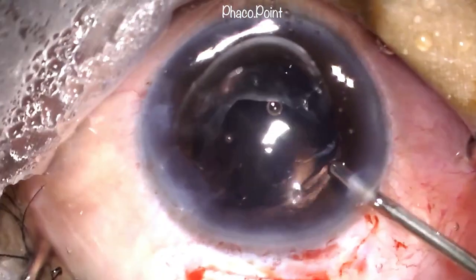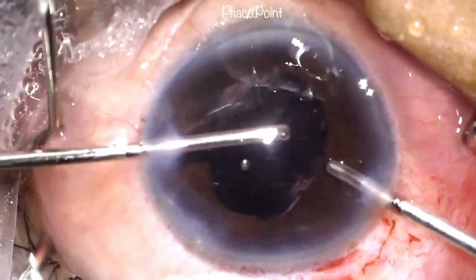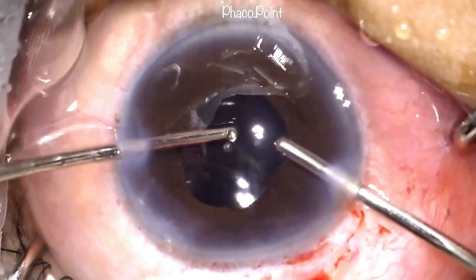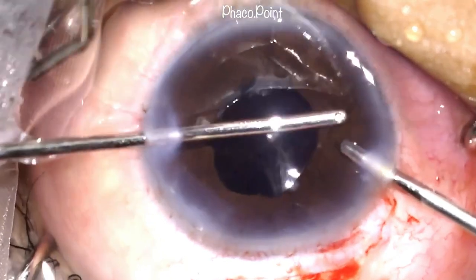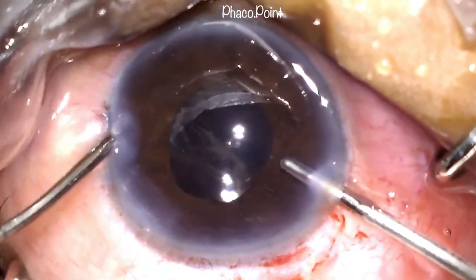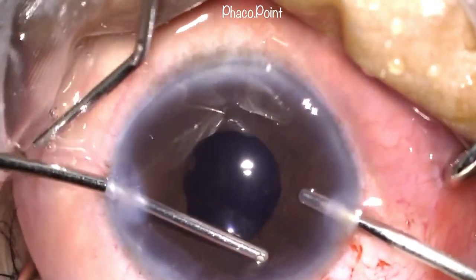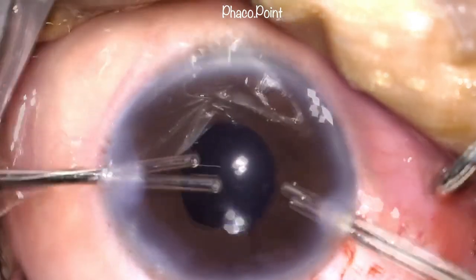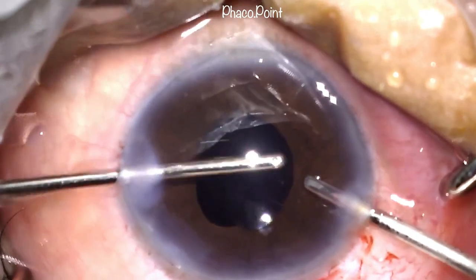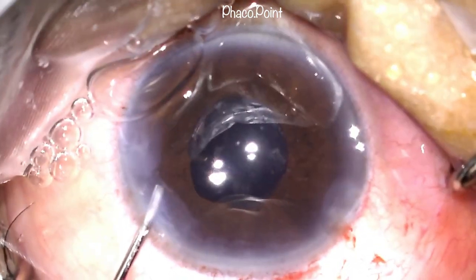The excessive viscoelastic is now cleared from the anterior chamber. As I've mentioned earlier, it is important to ensure that we do not let fluid go back into the posterior segment at this point, because it has the propensity to then further hydrate more vitreous and result in more of a vitreous prolapse. After ensuring all the viscoelastic is removed, the instruments are then removed from the eye.